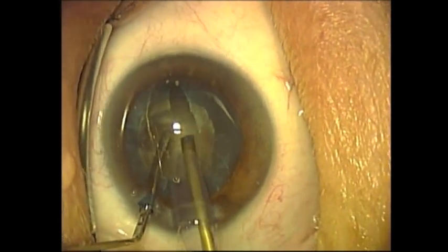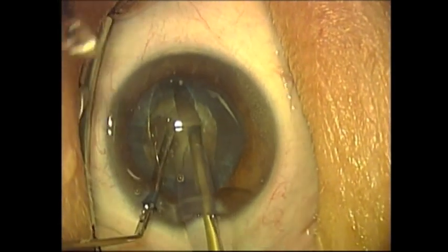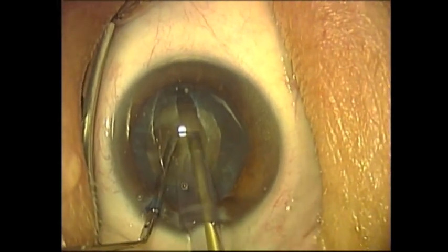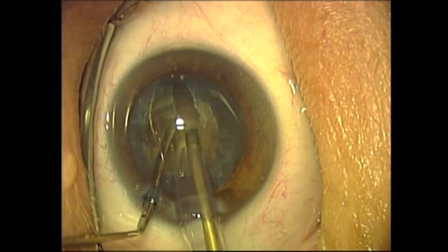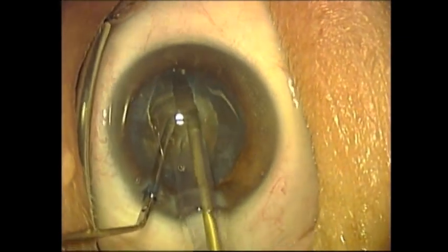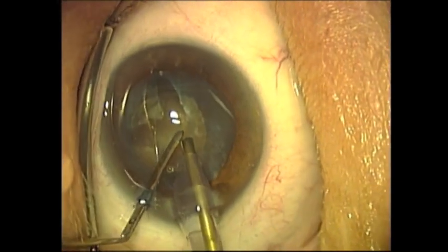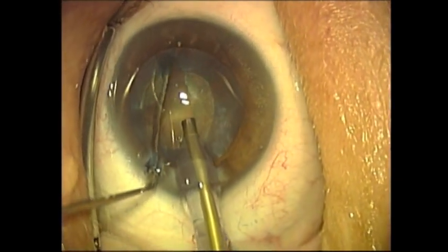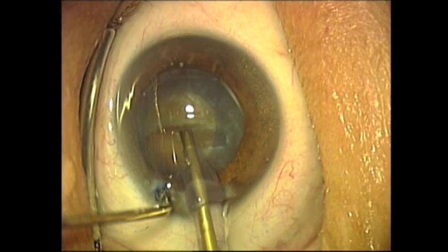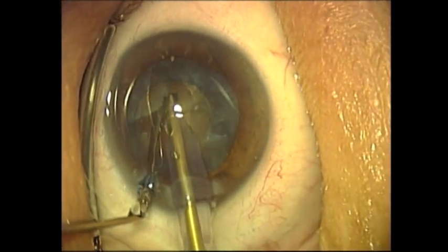This is being done under topical anesthesia. The patient simply has topical anesthetic drops. Mild sedation using Versed and/or Fentanyl is used. The patient enjoys the experience as the visual colors are quite breathtaking.